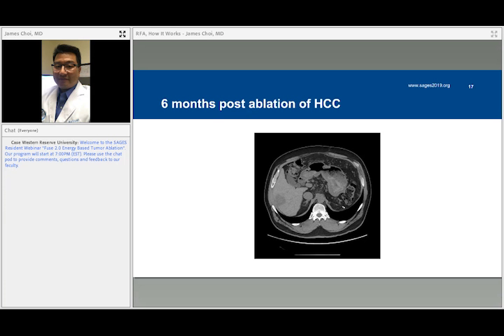And as you pointed out, from the very beginnings where we had 50-watt ablation systems, which were very weak, we now can ablate with over 200 watts. That's enough to light two 100-watt light bulbs in the abdomen. And indeed, when you ablate for a long time or many lesions, the anesthesiologist will tell you that the body temperature rises. That's how much energy gets deposited in these tissues.